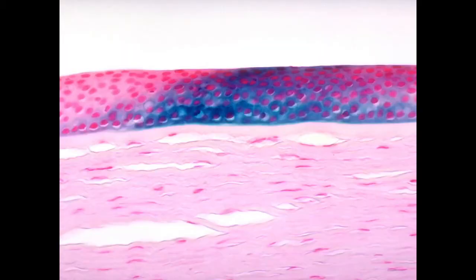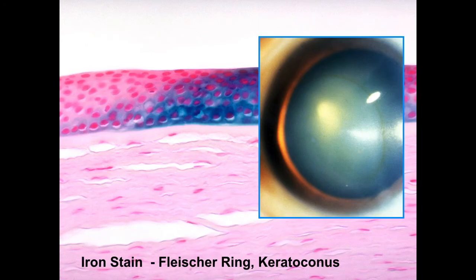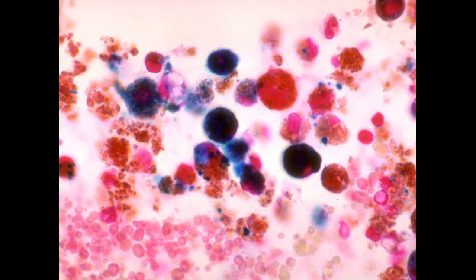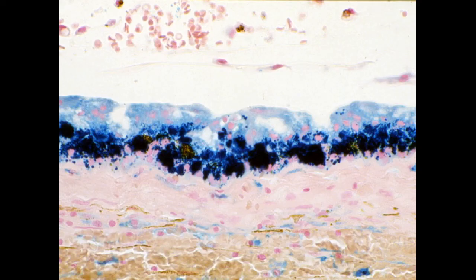This iron stain shows iron in the corneal epithelium in a patient with keratoconus who has a Fleischer ring surrounding the apex of the cone. This iron stain shows iron in hemosiderin-laden macrophages in a case of chronic vitreous hemorrhage. In this case of hemosiderosis, iron deposited in the ciliary body epithelium is disclosed by the iron stain.